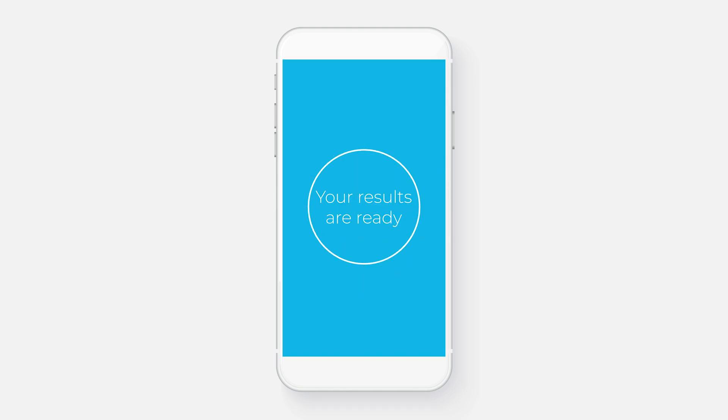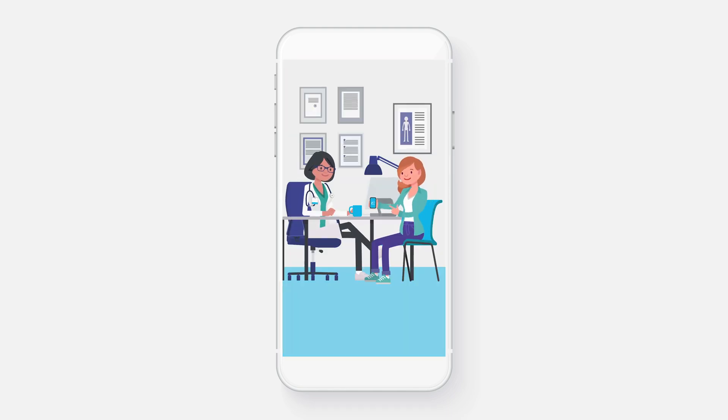That's it. Your results are ready. And you can choose to share your results with health professionals if you want to.